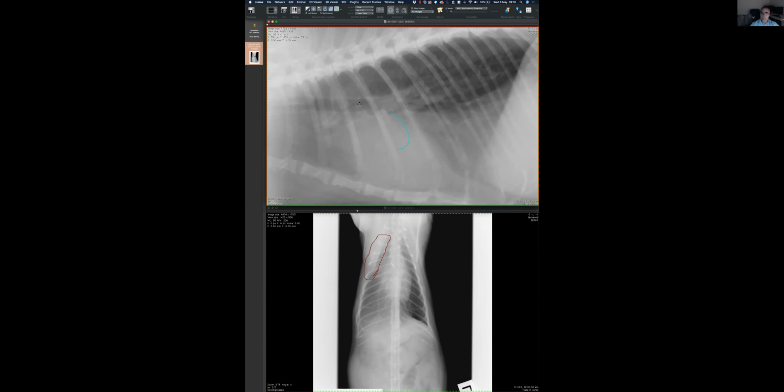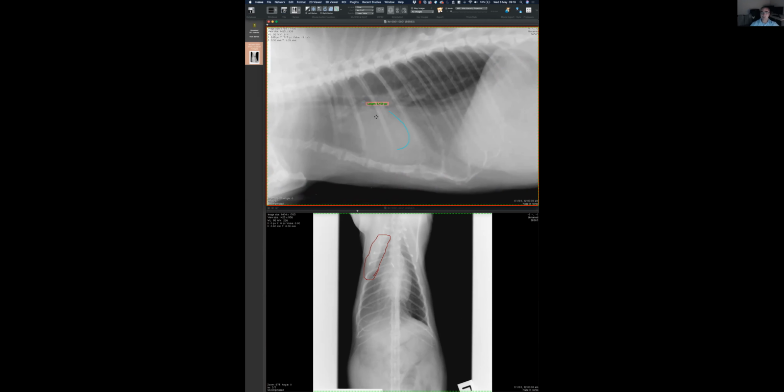There. Oh, these are not DICOM. But that's probably around 2 millimeters, and it's in that region and that opaque. I put a big question mark. Makes sense? That is very likely a vessel. It's not a nodule. Make sense?